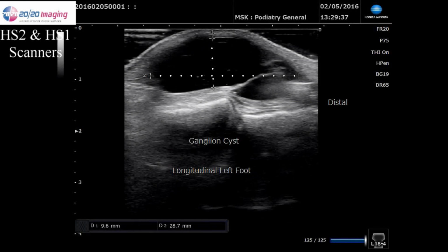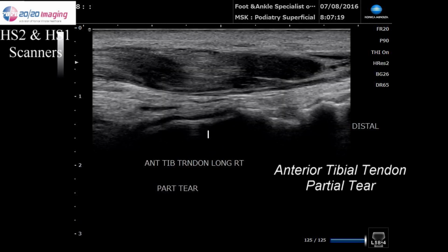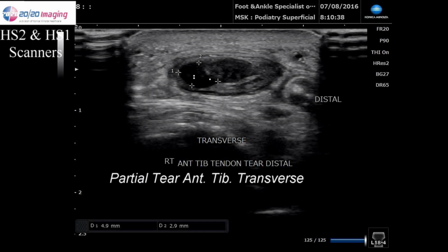Our next image will be a ganglion cyst, and note the septa within the ganglion cyst. Here's a partial tear of the anterior tibial tendon in the long axis. Let's rotate that 90 degrees, and the same tendon as you can see in the transverse axis.